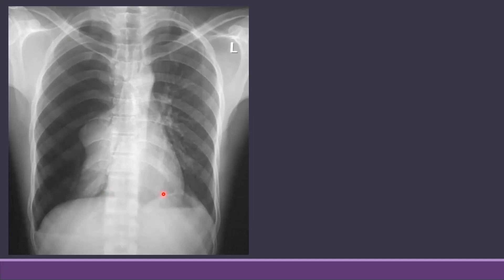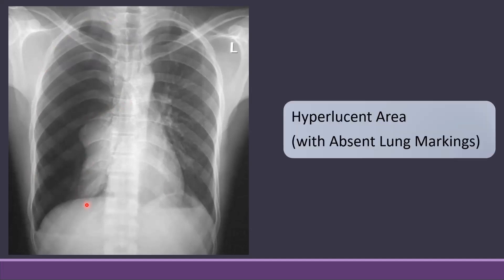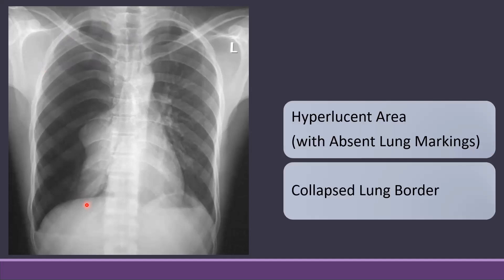So this chest X-ray is showing a hyperlucent area in the right lung field with collapsed lung margins, which are features of right-sided pneumothorax.